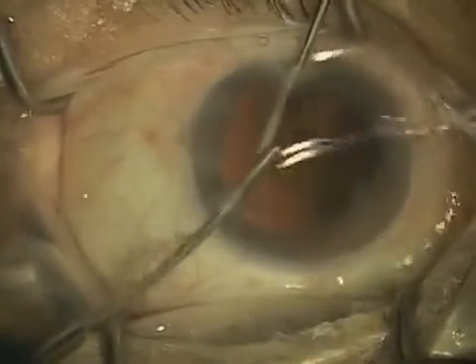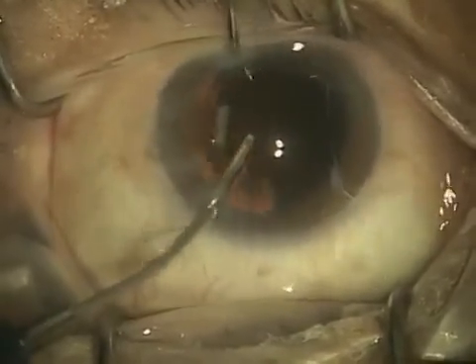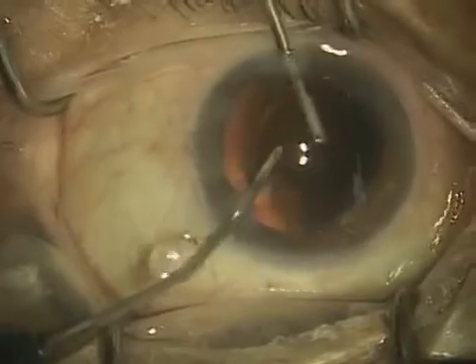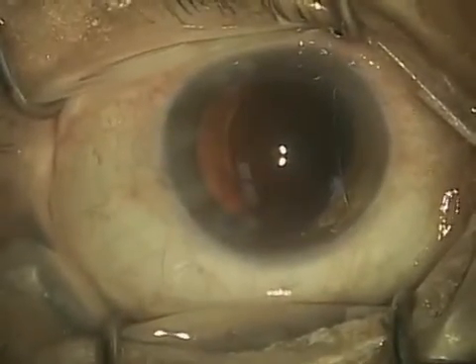So this is again a relatively straightforward step, but because you're dealing with such a delicate membrane, it's not a step that everyone takes.